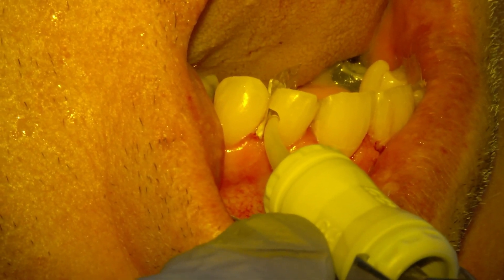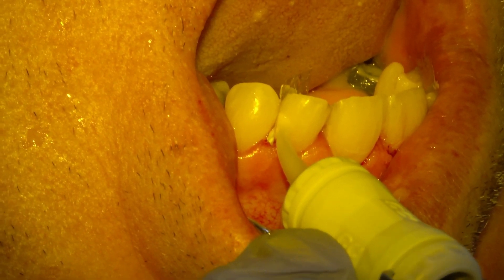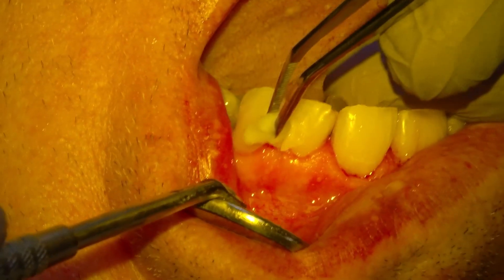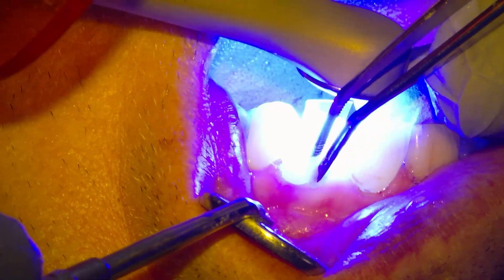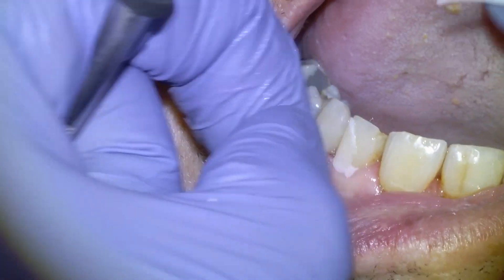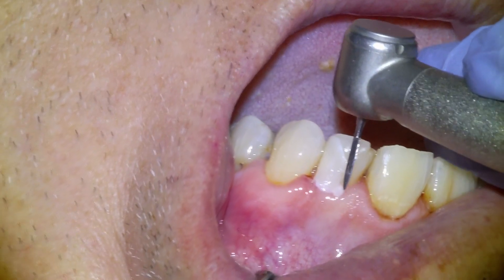Now we're ready to place our filling material. It comes in this capsule that gets mixed up, and then we're basically going to inject it into the tooth. I'll typically overfill the cavity and then pack it in place with this cotton pellet. The light curing unit is going to set the material.